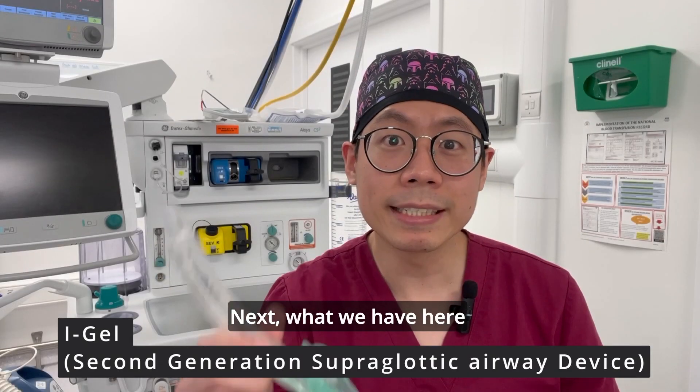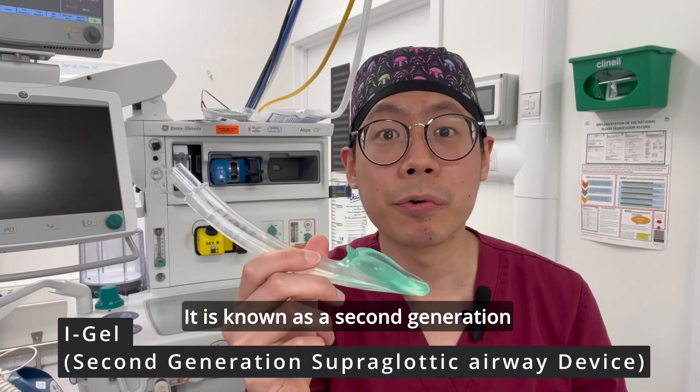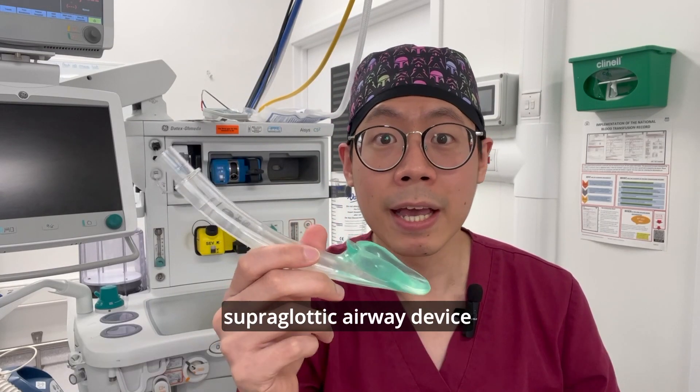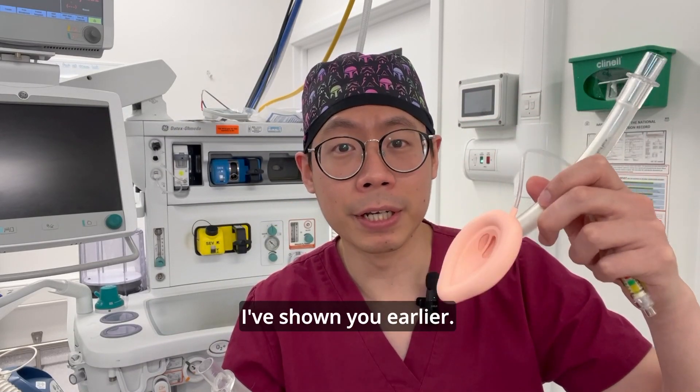Next, what we have here is the i-gel airway device. It is known as a second-generation supraglottic airway device, designed to improve on the previous LMA which I've shown you earlier.